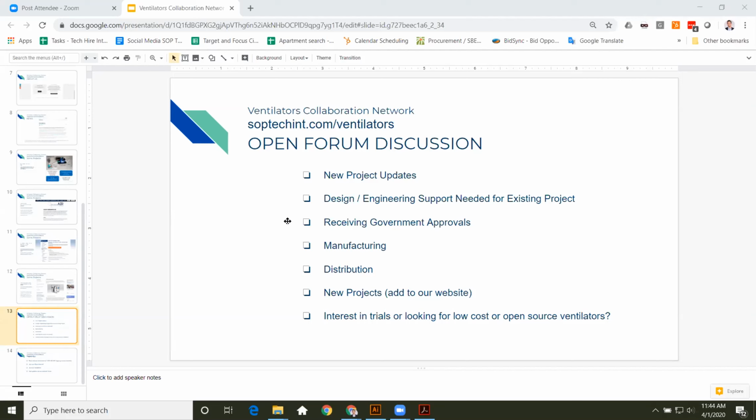The FDA doesn't actually approve the performance of a ventilator. It has a bunch of tests, like you can't have toxic plastic in it, and stuff like that. But they don't really test therapeutically that you do something. It's up to the manufacturers to prove that their design is safe and submit that to the FDA.